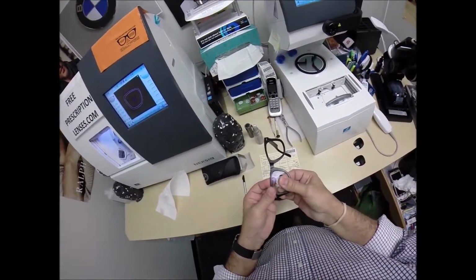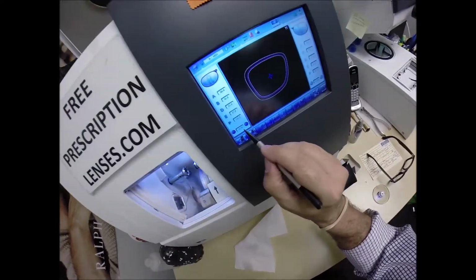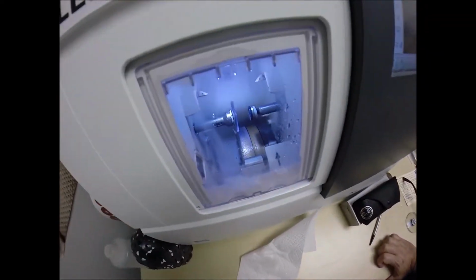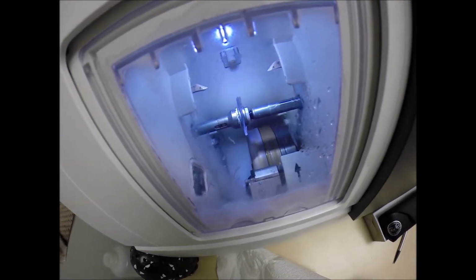Tuck the lens in at the outside corner. Yeah, not even close. Let's go down another 1/4 millimeter. So we're at minus 0.50. Put it back in, hit retouch. The old carpenter saying: you measure twice, cut once. You can always cut more off of a board. You can never add it back on.